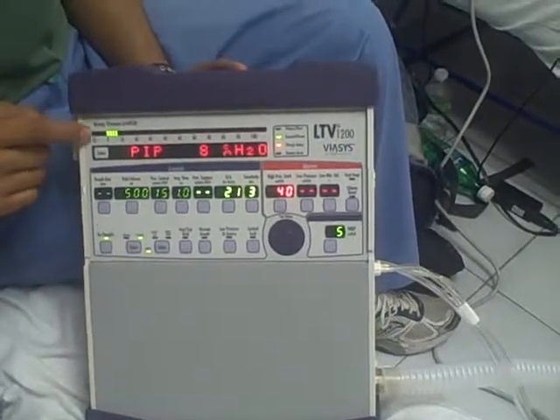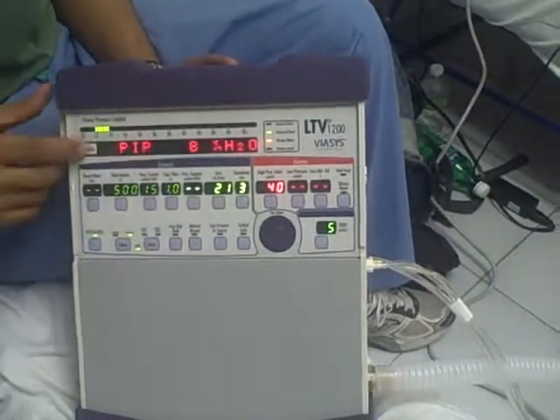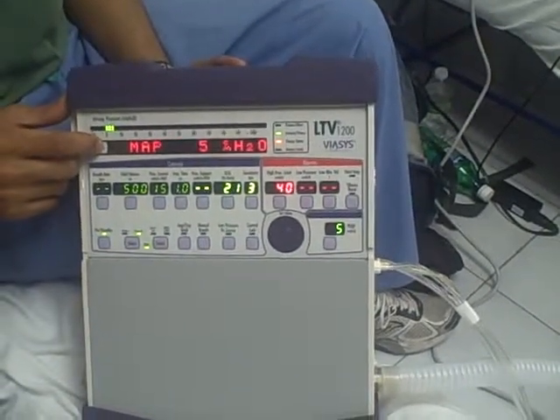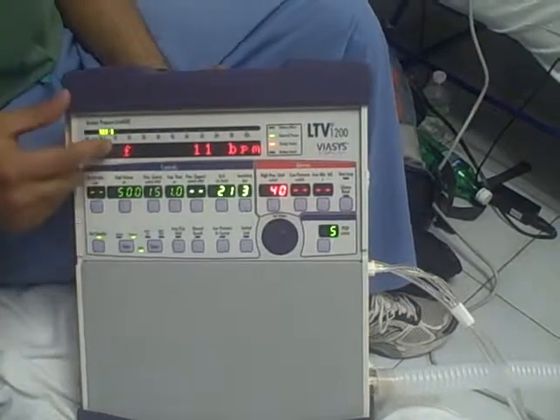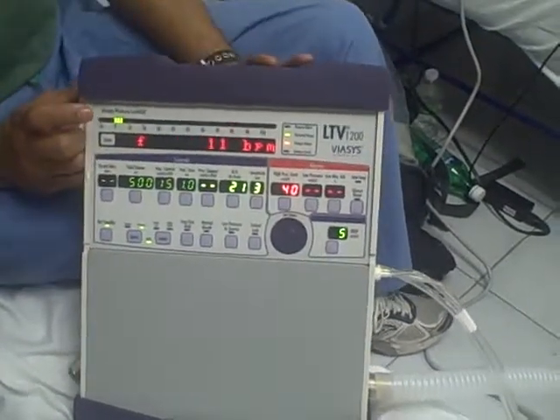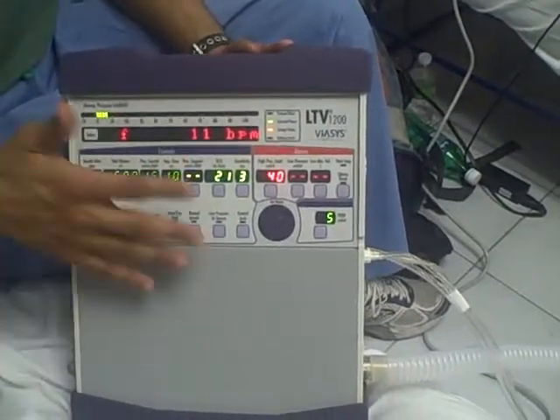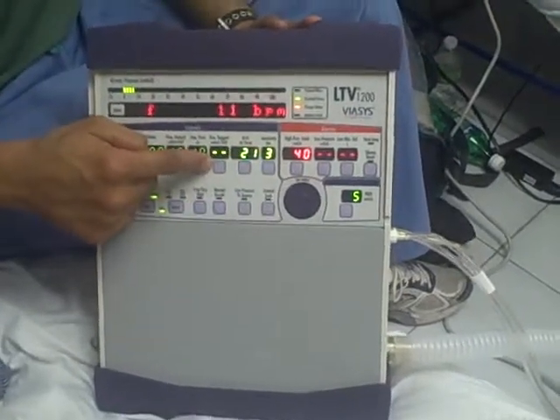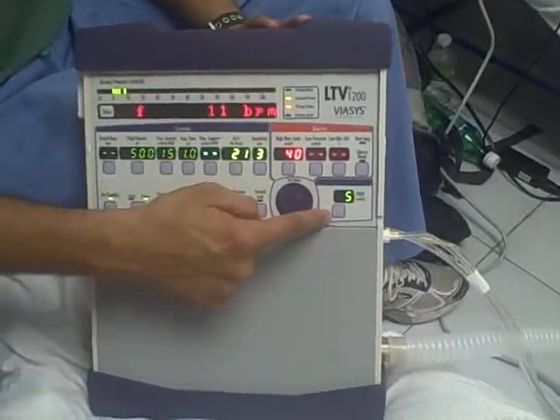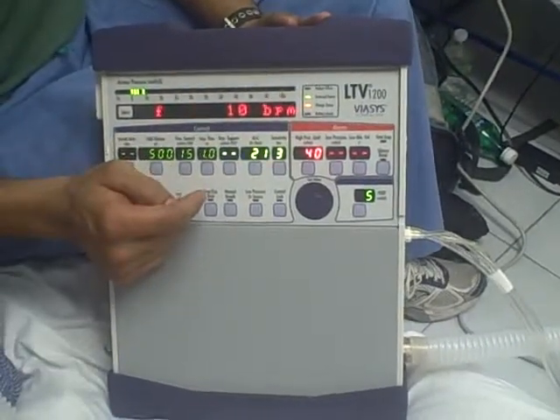That's an average. You can also get a sense of the peak inspiratory pressure by looking at this top gauge. You can cycle through, you can play with this. There's MAPs, there's PEEPs, and then eventually we'll get back to the respiratory rate. But we're here to talk about alarms. This patient is currently on CPAP alone. The way you know that is because the pressure support is down to 0 and the PEEP is set at 5, which is a CPAP mode.